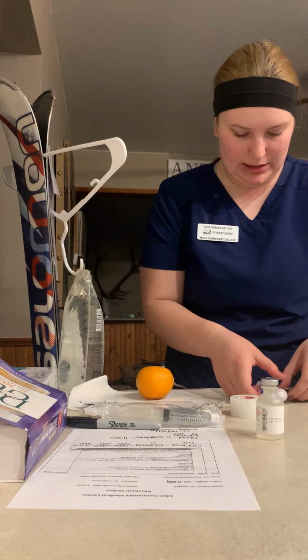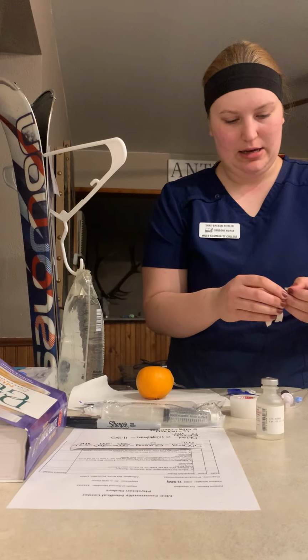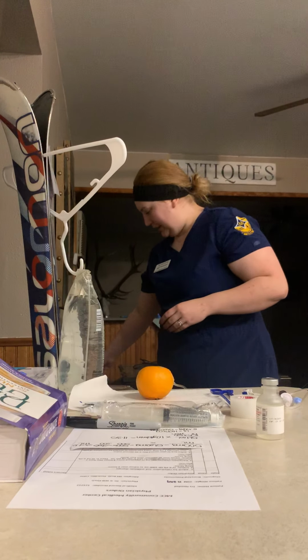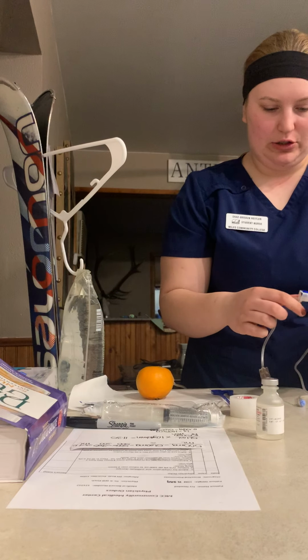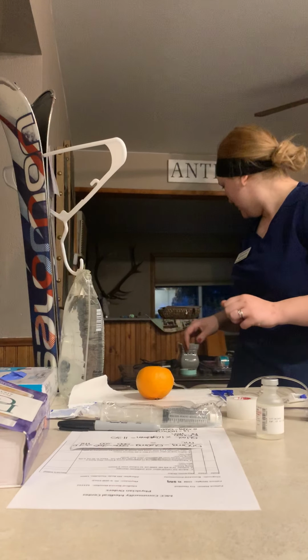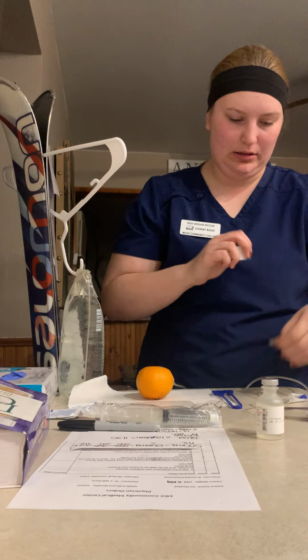Got my tubing. Get this all out. Make sure you have the correct tubing too, because this is especially for piggyback, so it comes with your little hanger too, and it's shorter than the primary line. So first thing I want to do is clamp this line, and I'm going to label my line as well.